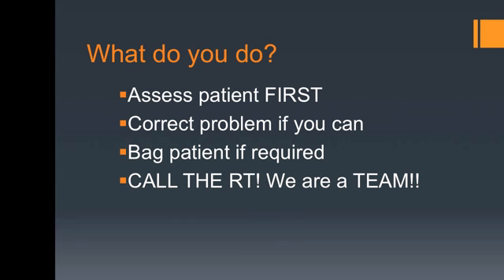We are a team. You should not be repeatedly silencing an alarm on a ventilator. You need to get to the root cause of the problem. But remember, we have a respiratory therapy department because they have specialty training. So call them and utilize them.